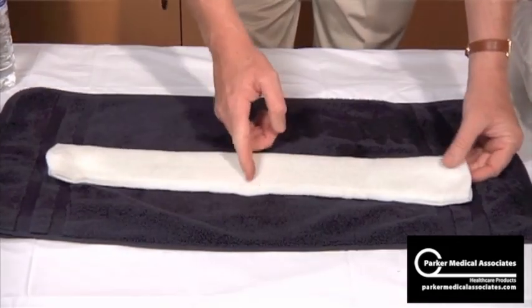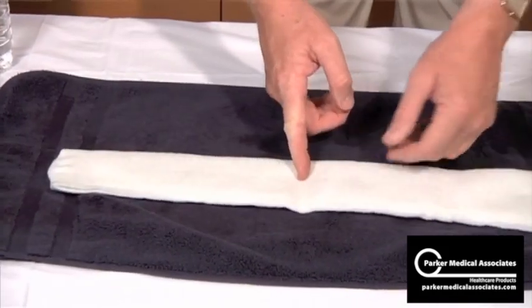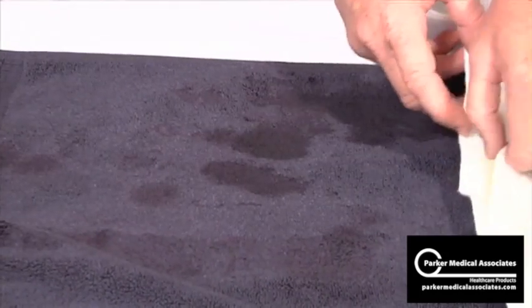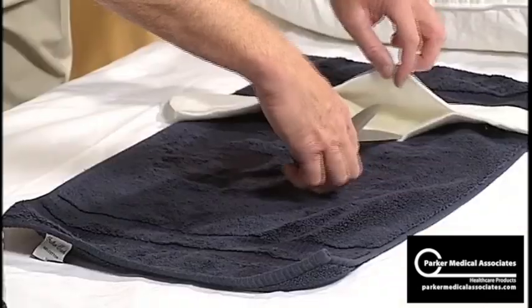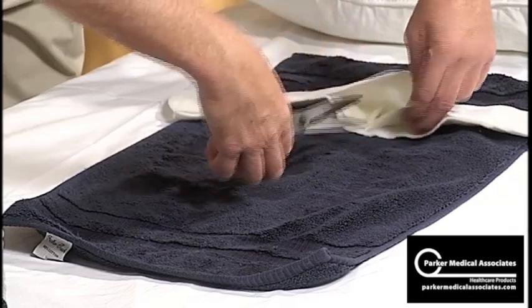Now what I do here is fold this in half, open up the double-faced tape, expose the fiberglass, and then just cut away one inch of the fiberglass from the middle — just the fiberglass only.